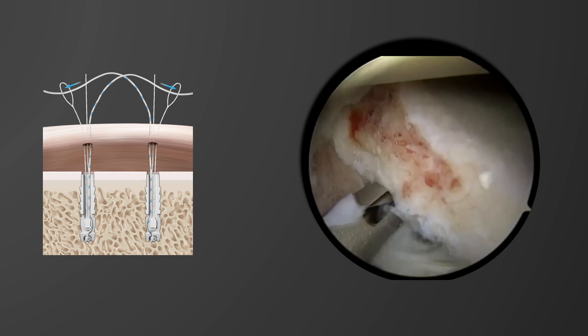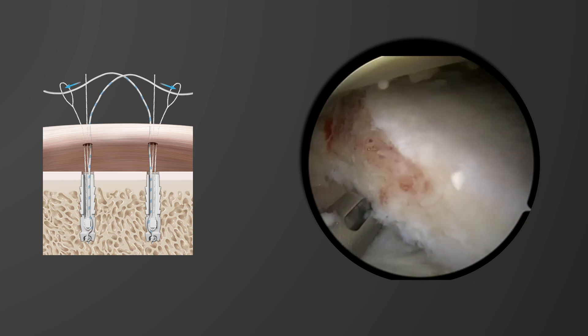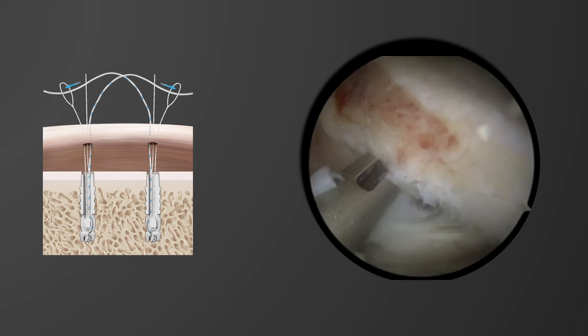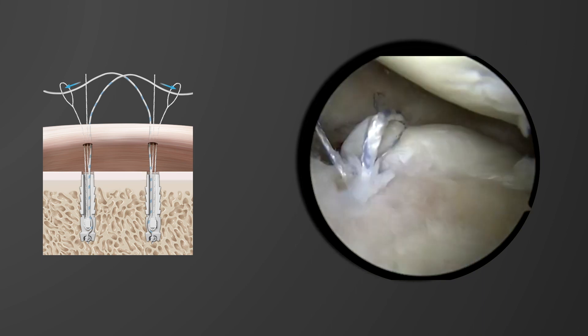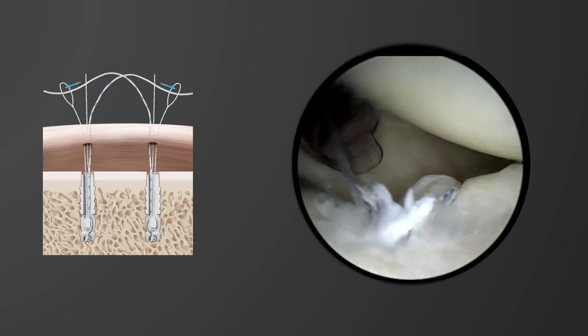The percutaneous kit was then used to insert the medial portal, starting with a spinal needle to localize the position. The drill guide can then be used to drill and insert the medial implant. The lateral implant is inserted in a standard fashion through the anterior portal, and then the repair stitch from the medial implant is shuttled through the lateral implant, and the repair stitch from the lateral implant shuttled through the medial implant.